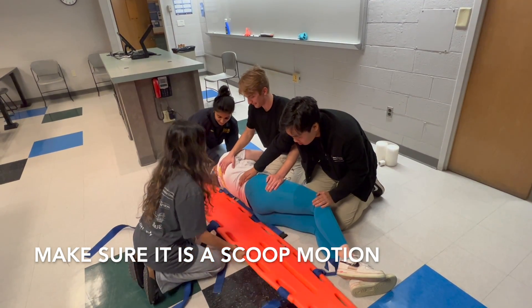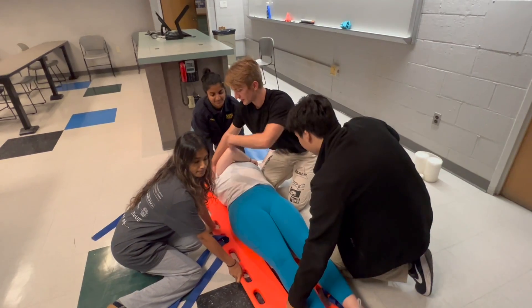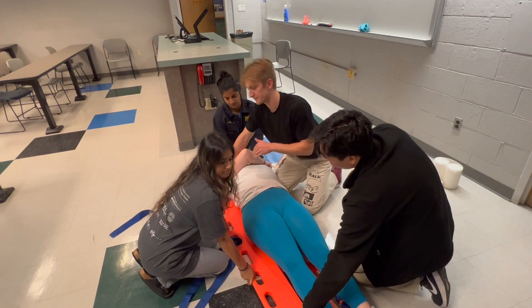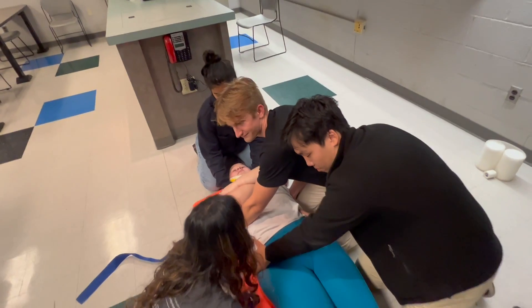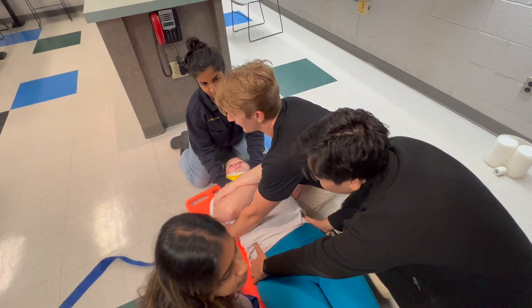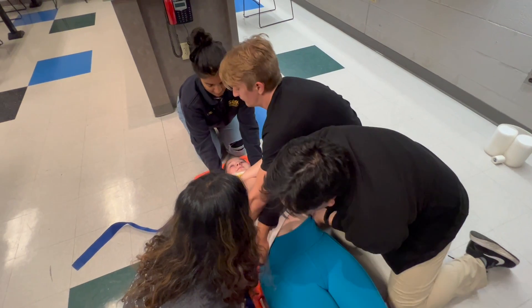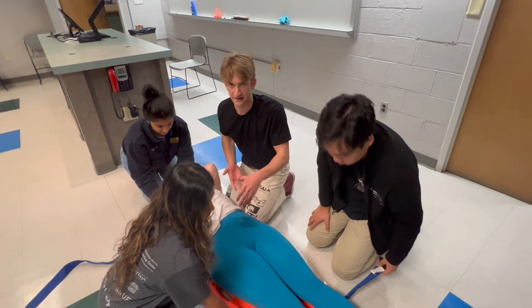On Ishani's count we will lay the patient onto the spine board in a scooping motion. Note that at this time the patient is fairly close to the center of the spine board, but there's still a little bit of movement needed, so we're going to move the patient in a Z formation — mostly up and down — to make sure the spine is staying in line to get them into the center. I'll grab under the patient's arms around the ribs and Andy will grab around the hips, with Ishani again leading the movement as the person holding the head. Notice how we also make sure the board is staying still, because you don't want to slide the patient and the spine board at the same time.